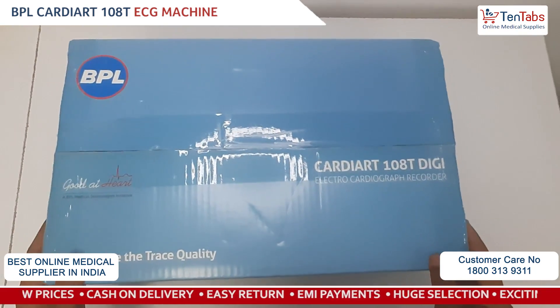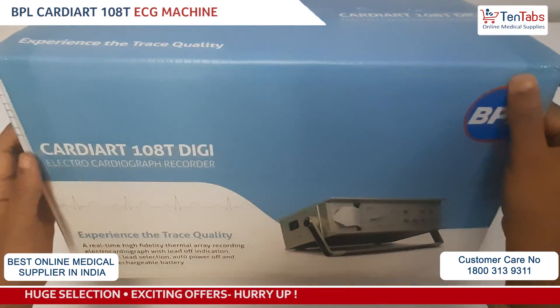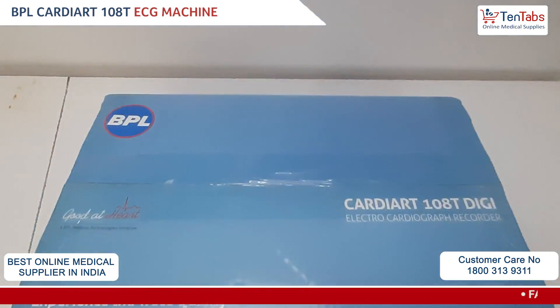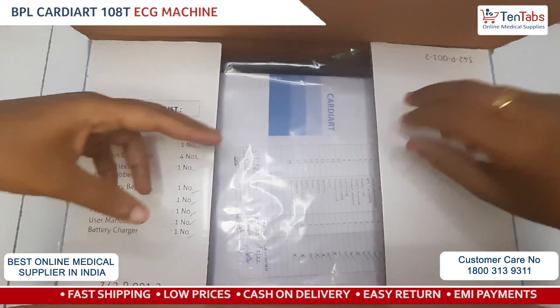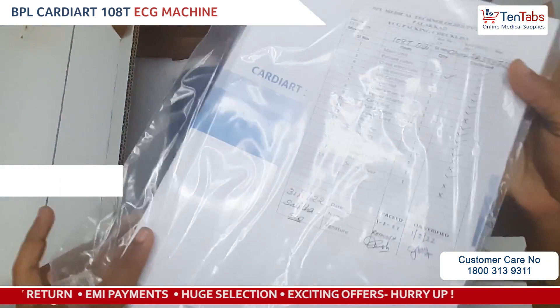Hi y'all, today let's make an unboxing and installation video for the BPL Cardiart 108T Digi, which is a single channel ECG machine. First let us begin with the unboxing. Here we see we have the user manual with the checklist.